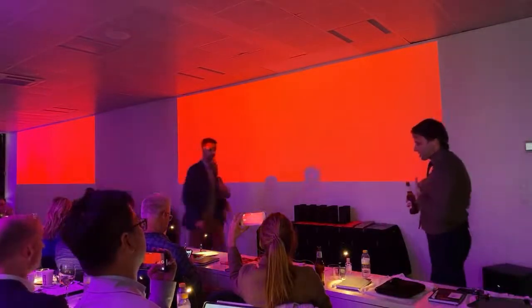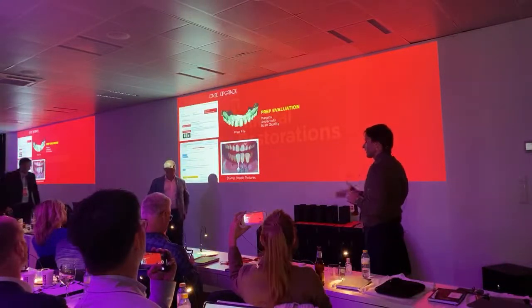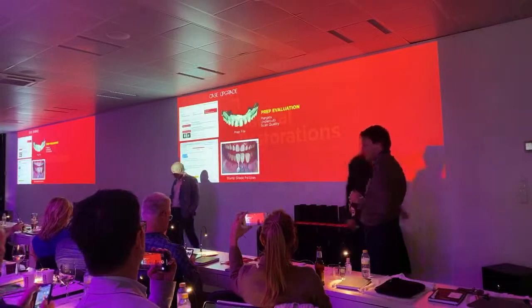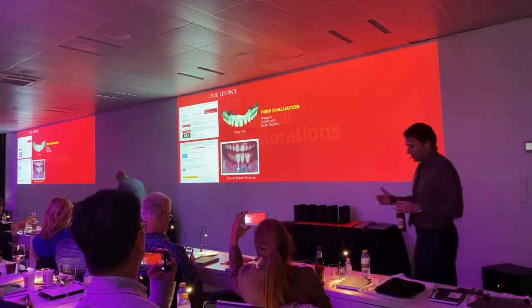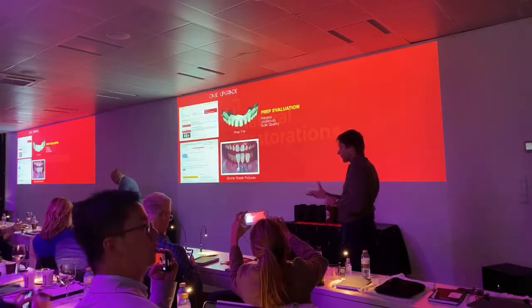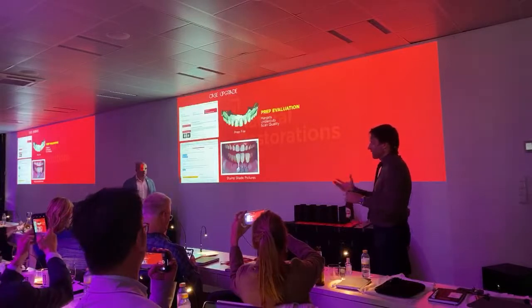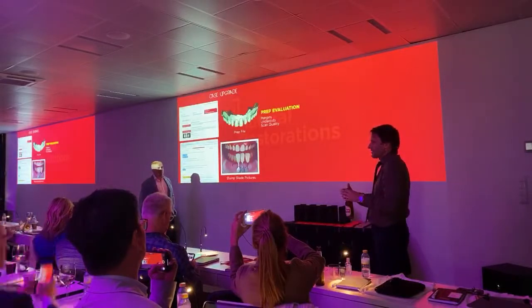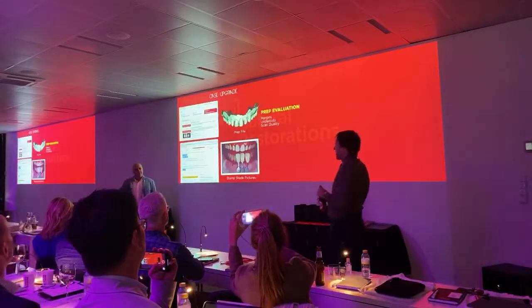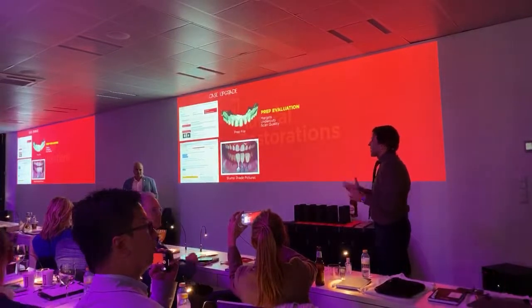We have, of course, this is where I worked for 20 years, the lab, and now for me being able to go back to the lab and start working on these cases, we understand that there's a couple of reasons why CAD/CAM restorations don't work, or they don't fit, or they don't fulfill your expectations. One reason is just regular restorative reasons that with digital or without may happen, unexpected things, right? Problems with the color, problems with the fit, problems with things that are out of our control many times.